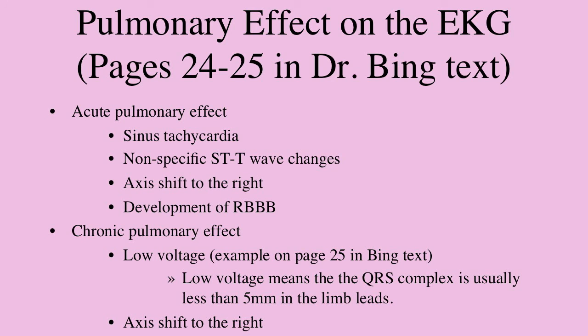But we do want to be aware, for this course, since it's an EKG course, that pulmonary disease sometimes does alter the EKG in some ways. This will be fairly quick, but we want to look at some of these things that can occur. And you can follow this in the Dr. Bing text, pages 24 and 25.